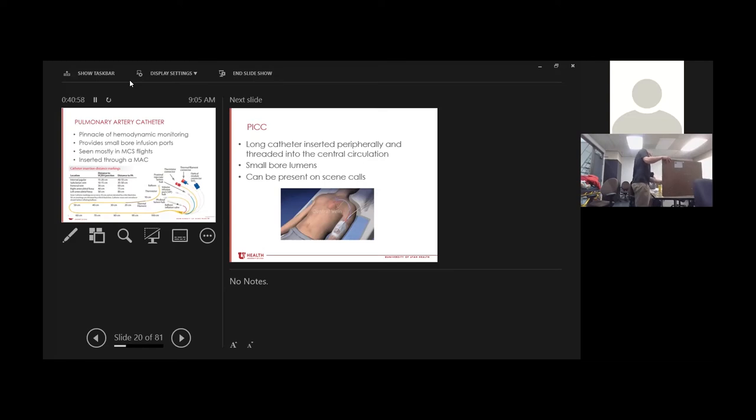Then you're going to flow this catheter, and we're going to be reviewing this. So after the SVC, we're on what vessel? On what part of the heart do we go to? Atrium. What valve do we go through next? To the tricuspid. Tricuspid, beautiful. What chamber is this? That is the right ventricle. Beautiful. What valve? The pulmonic. Perfect. And then what vessel? PA. Perfect. Right. So pulmonary artery catheter. It's going to sit in the pulmonary artery.